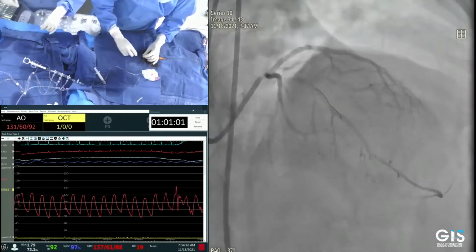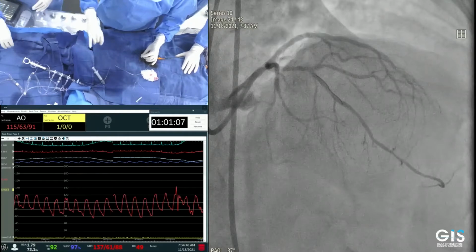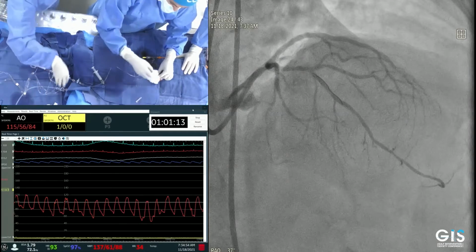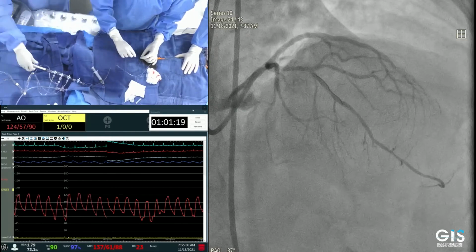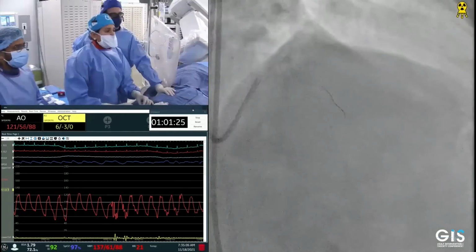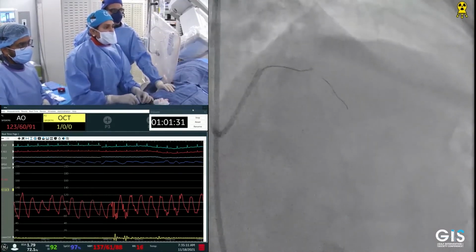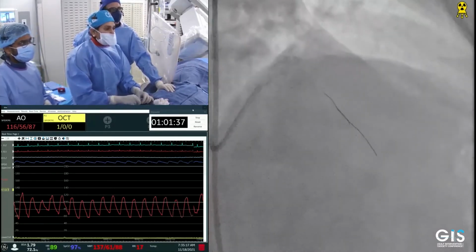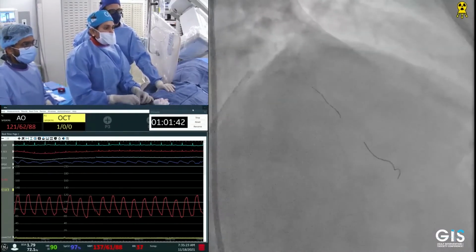Now, going back to the various atherectomy devices that are available, there is rotational atherectomy, orbital atherectomy. My question is, how could the imaging system help us in deciding what kind of modality we'll use? OCT will tell you the images. Then IVUS will tell you that the calcium is severe. Then we as interventionalists have to make a decision, is it rotational atherectomy or orbital atherectomy that we want to use?